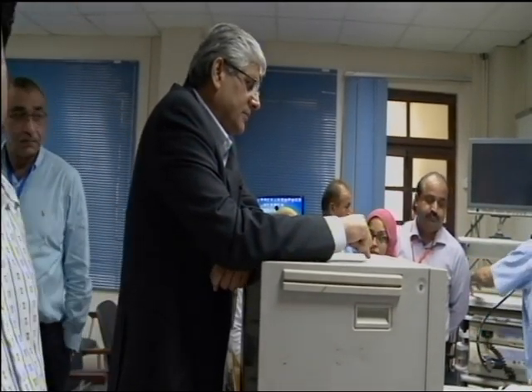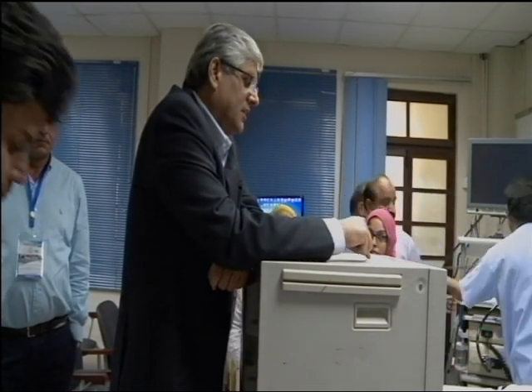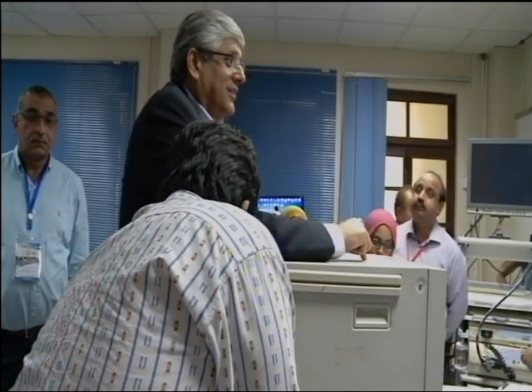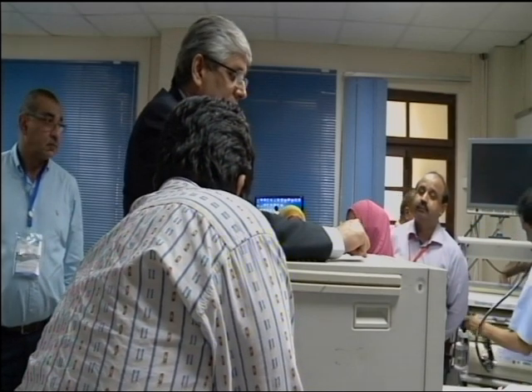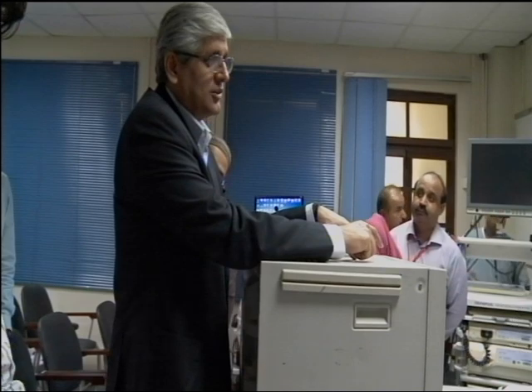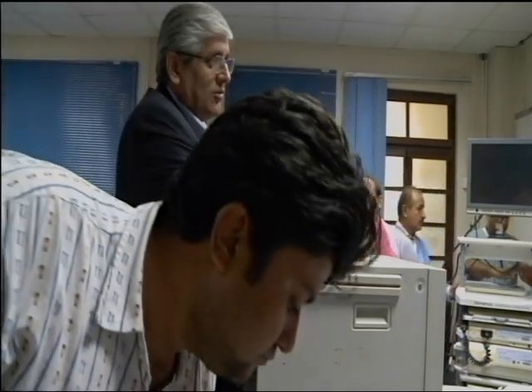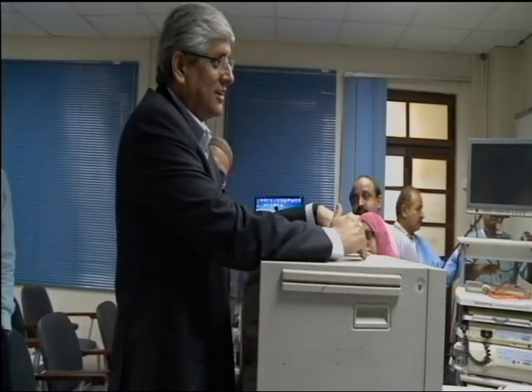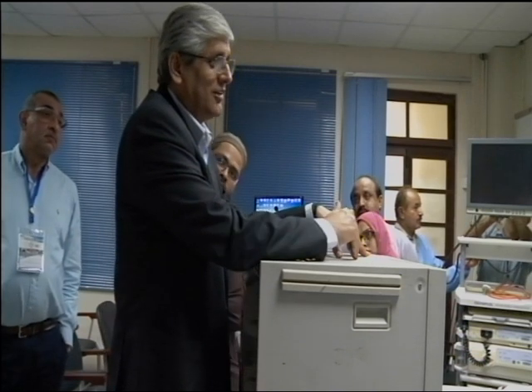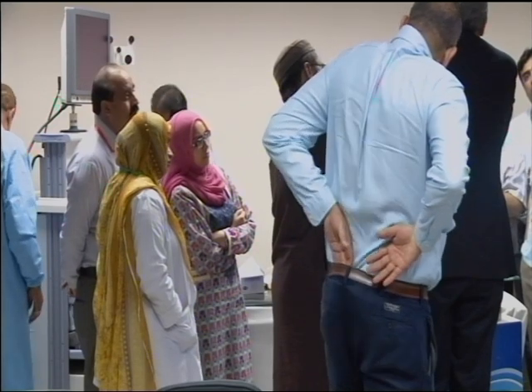Even in the two things that were looked at with fluoroscopy and with the new technique, where people thought they were in sigmoid, these are some of the best guides. If you're in sigmoid and in rectum, or rectosigmoid, you know you're there, for sure. As you go further down, in one of the files we looked at, people said they were in transverse colon or they were in descending colon or they were in ascending colon. 70% of the time they were right, but 30% of the time the world experts were not.